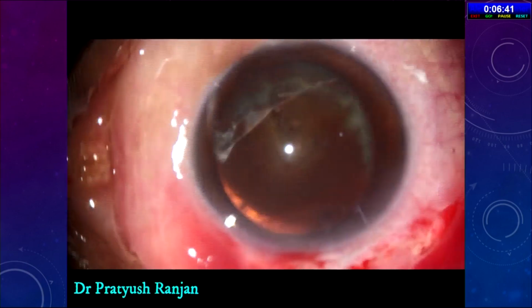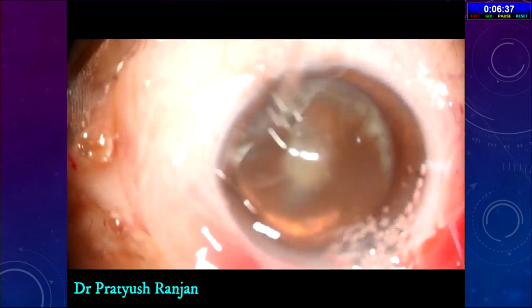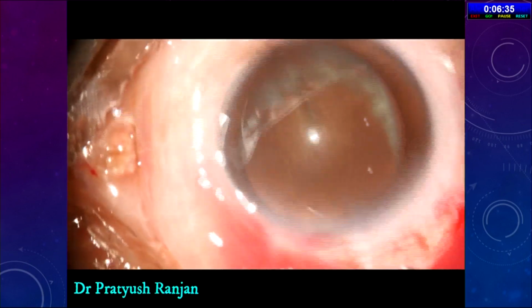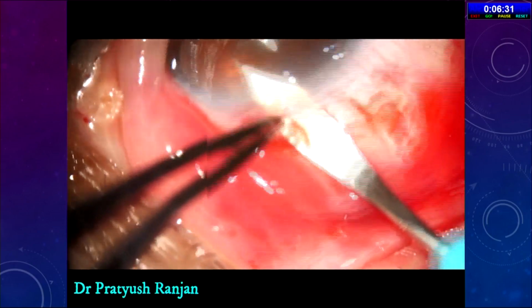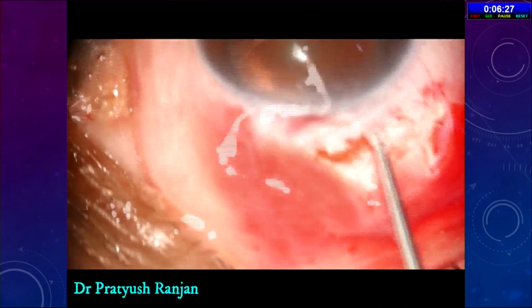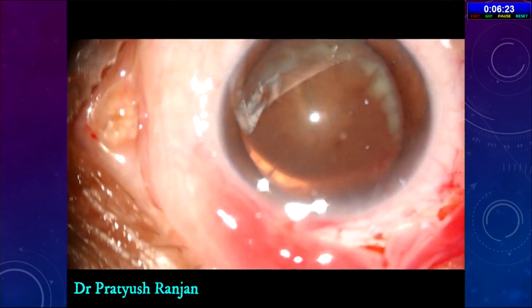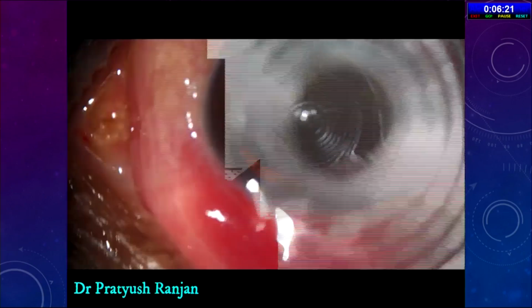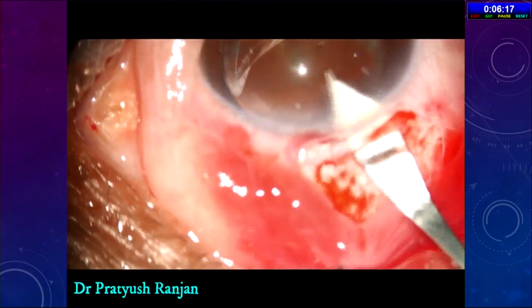Check again with the keratoscope whether the mires are now circular or not, and then move ahead. This takes a lot of time and a lot of patience, and repeated visco stretching is required. So surgery becomes a little lengthy, but the time of surgery should be the least priority for a surgeon. They should give a good result.